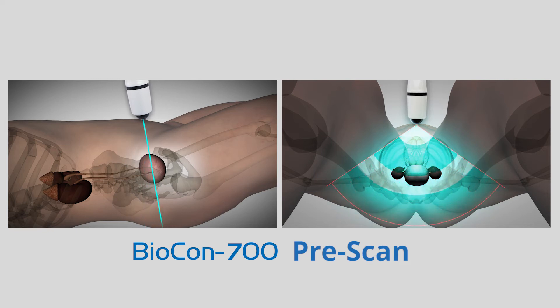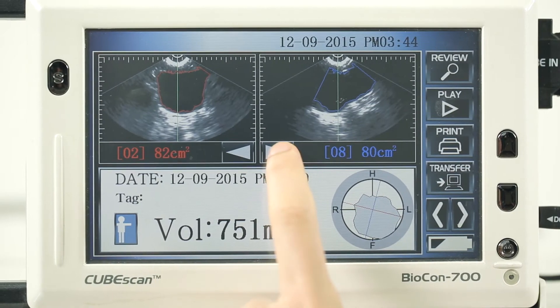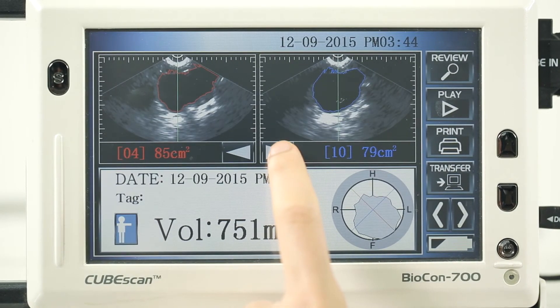Hold the probe steady while scanning. Press the right or left arrow key to check all 12 frames.